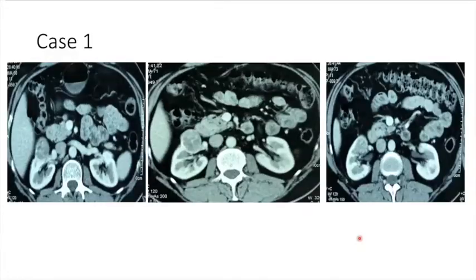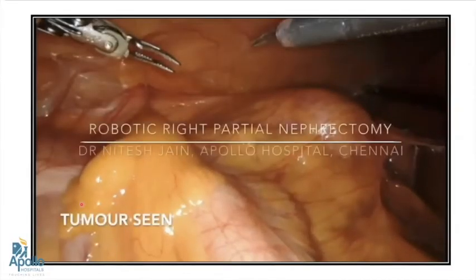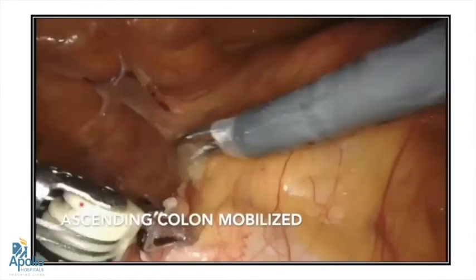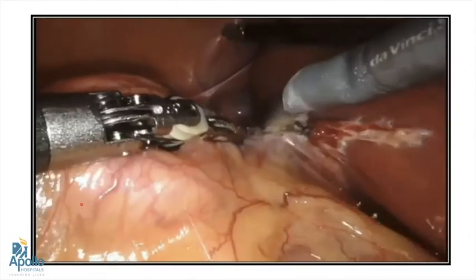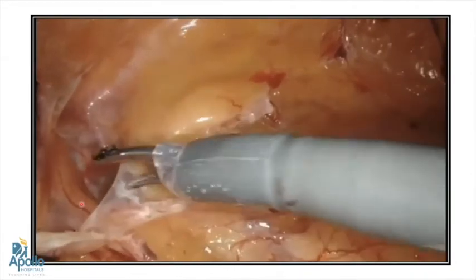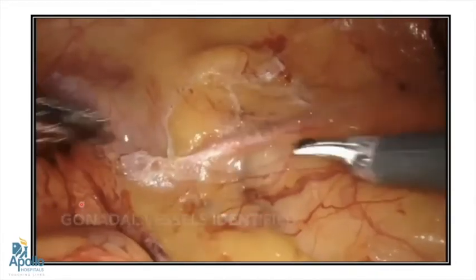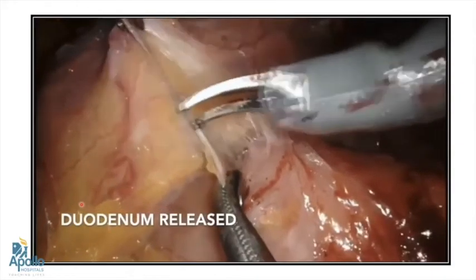Case number one is a complex partial where the tumor is located on the anterior hilar lip. These are hilar tumors lying very close to the anterior hilar lip. Surgery starts with colon mobilization, using blunt and sharp dissection with good traction to identify the right plane. The duodenum needs to be kocherized medially.